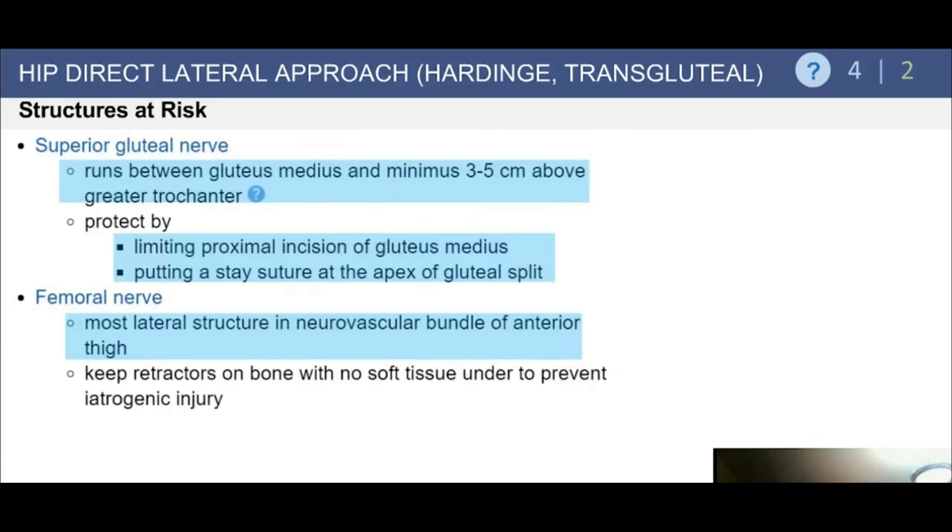Structures at risk include the superior gluteal nerve and the femoral nerve — the most lateral structure in the neurovascular bundle of the anterior thigh. Keep retractors on the bone with no soft tissue interposed to prevent iatrogenic injury.